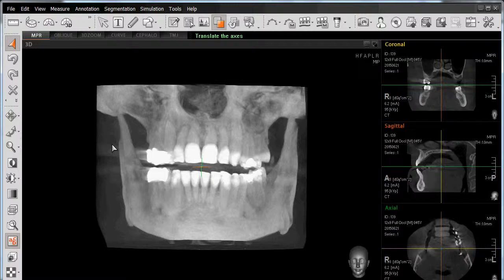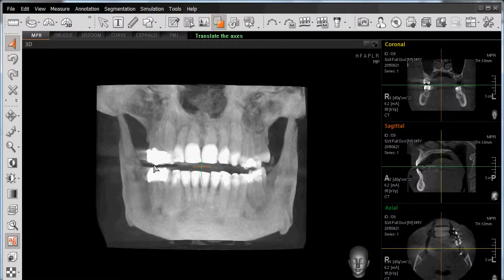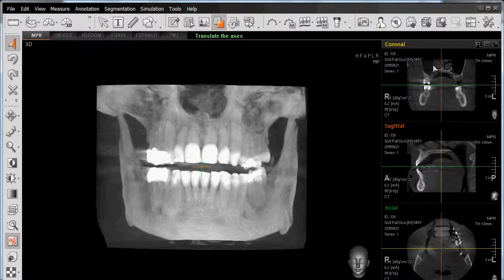We were also able to apply coloring to our virtual rendering, and in this case, if we wish to remove the air and soft tissue we see here, revealing just the hard tissue, enamel, and so forth, we have a function called windowing, which is also accessible through our fine-tuning icon.